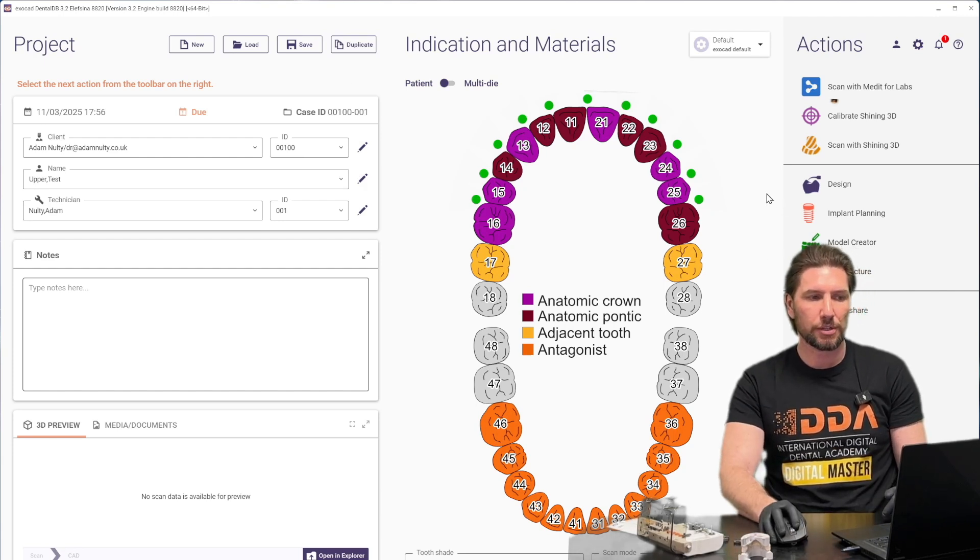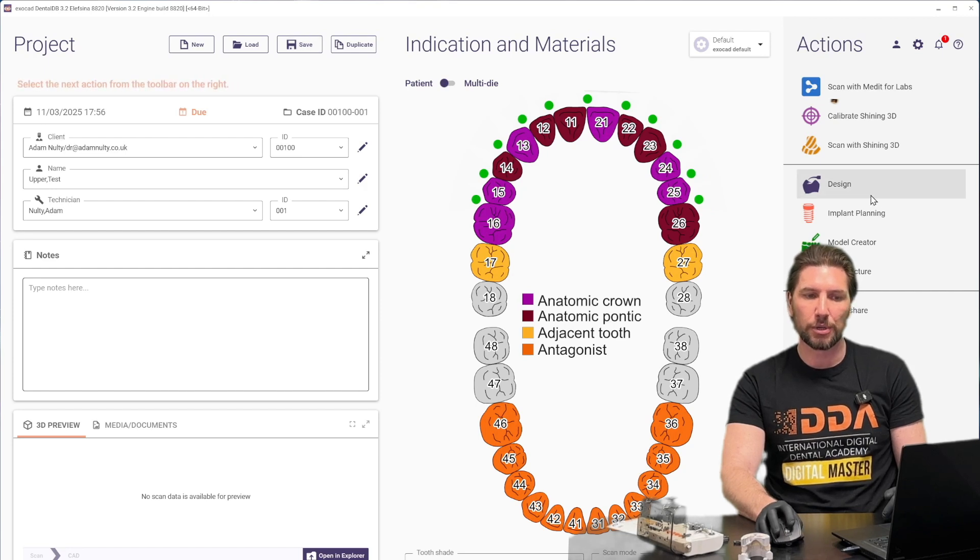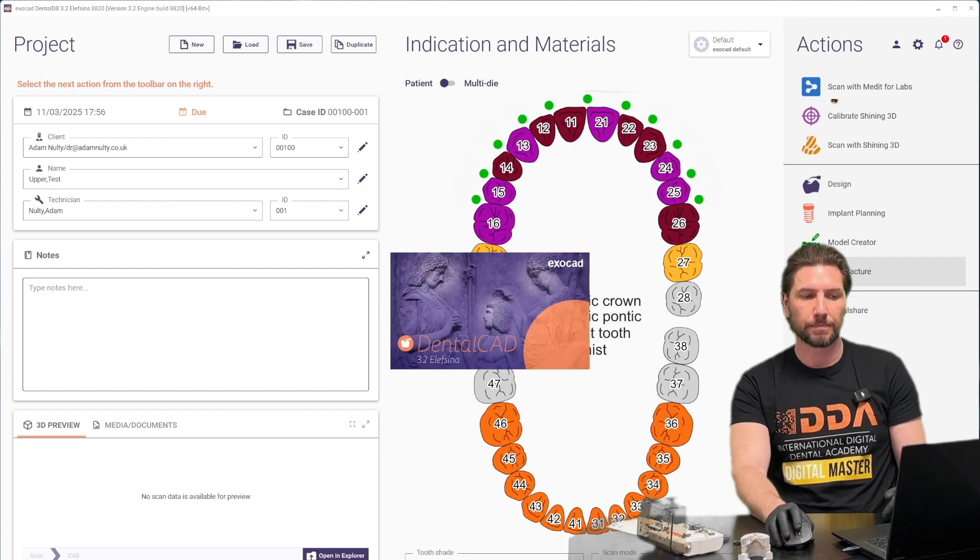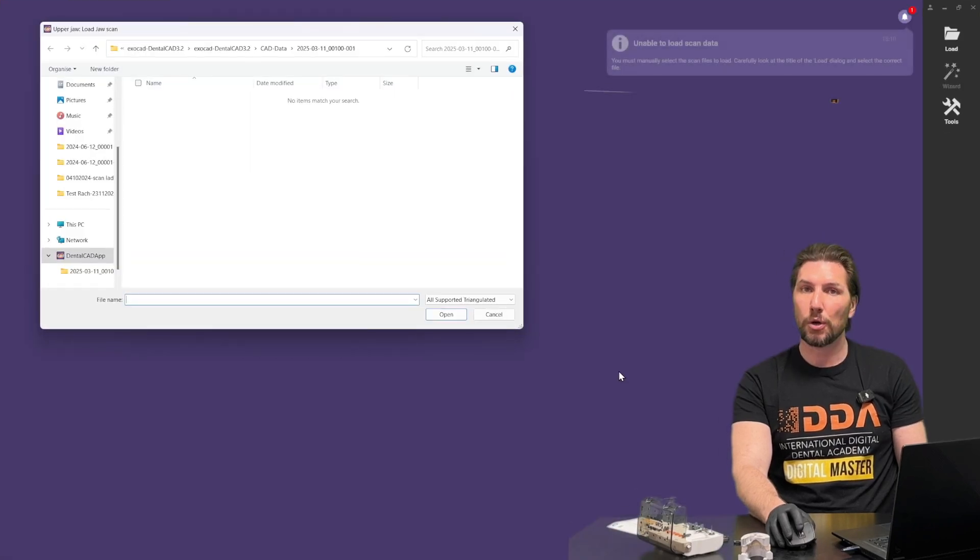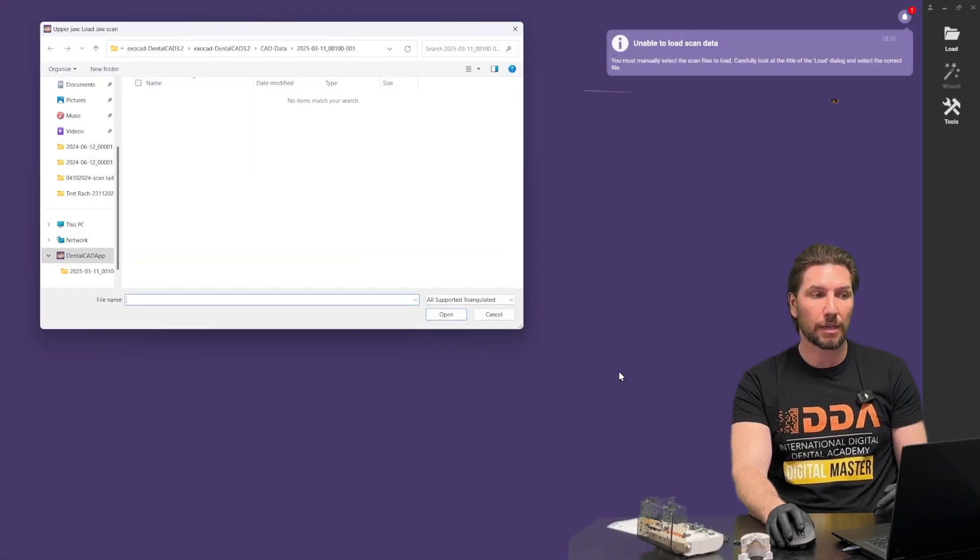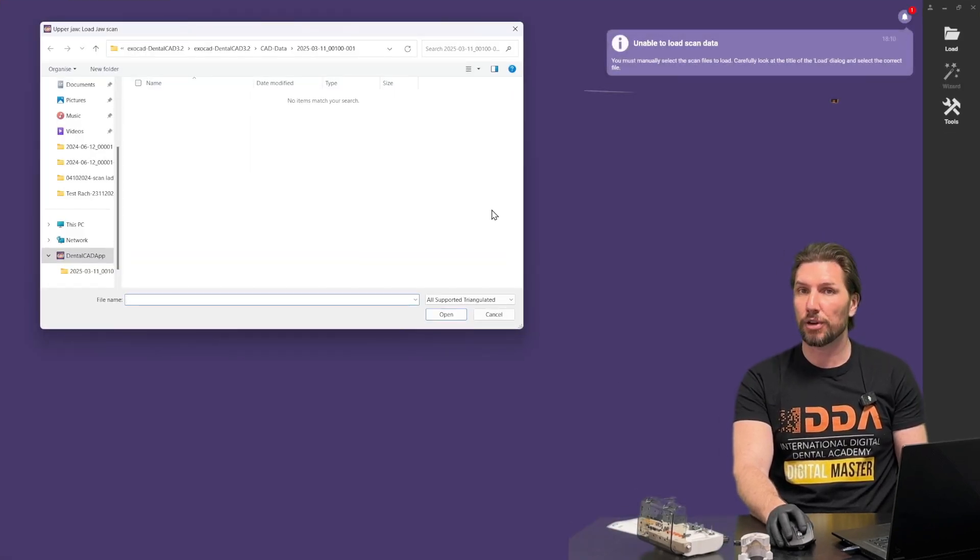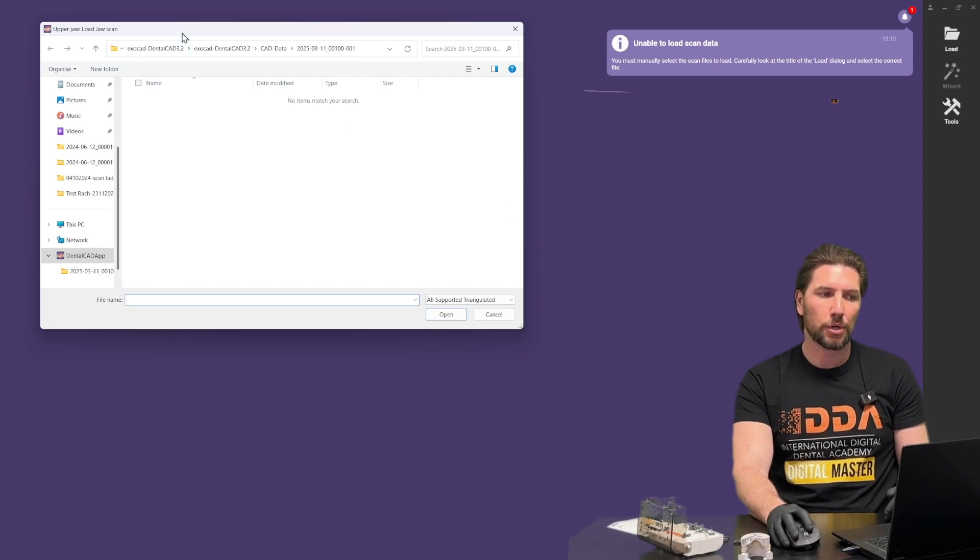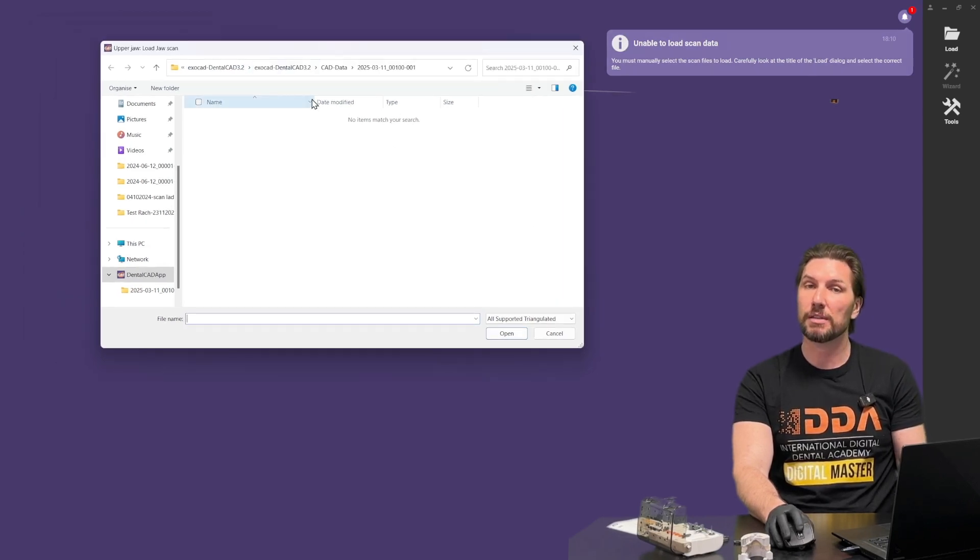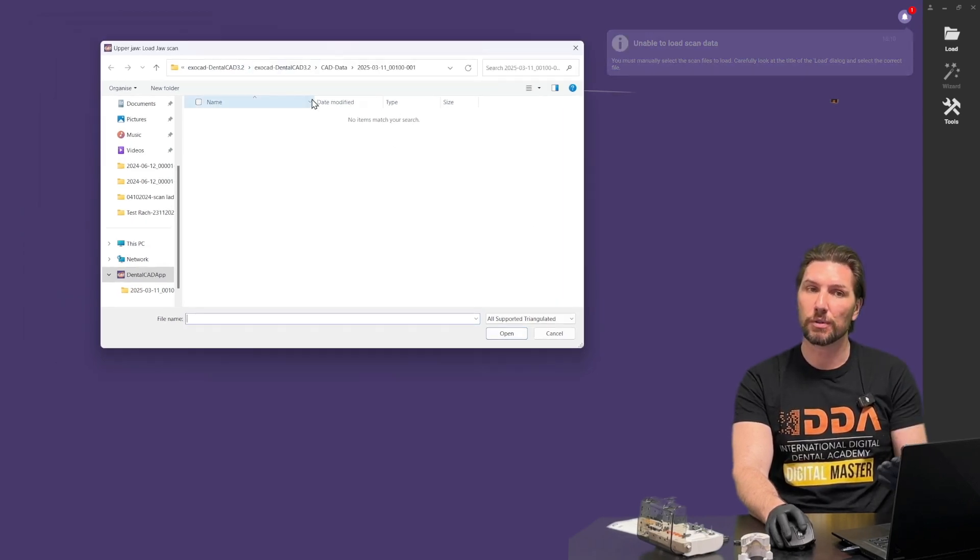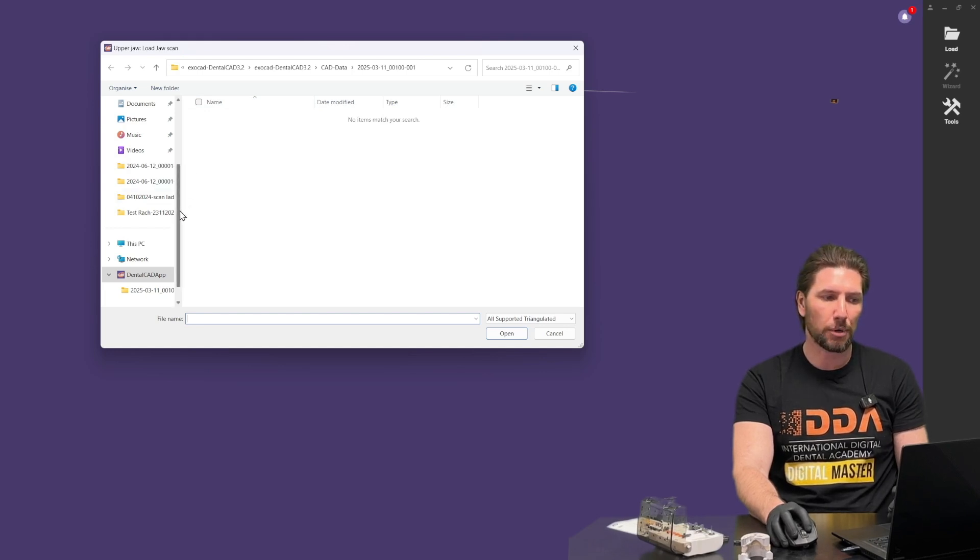So the first stage here is we've saved everything, we've set up the arch and we're going to click design. That will load up the dental CAD software which will then ask to bring in the data. So the upper jaw, that's the scan that we're going to bring in is the gingival scan because we're going to bring in the scan ladder scan bodies separately.